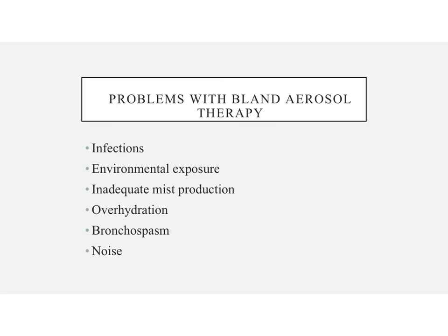Overhydration is another problem with bland aerosol therapy. This is more commonly seen in ultrasonic nebulizers, which we will go over when we talk about aerosolized medication. But if we accidentally overhydrate a patient, how would the ISB shift? So the ISB would shift up because it's not going to take as long for the gas to hit those ISB conditions, the BTPS conditions.